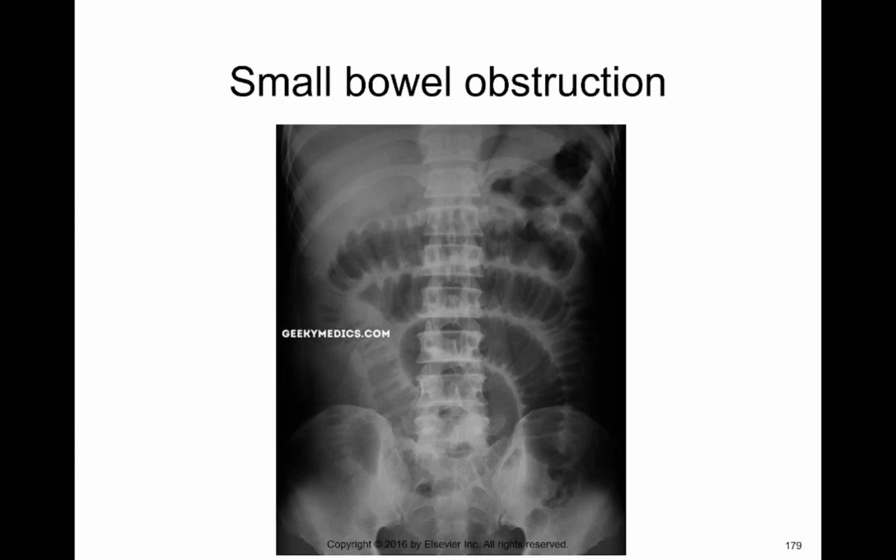a cancer, it could be because of a twisting of the bowel, and the visualization of that is what we refer to as a bird beak sign, and what we call that is a volvulus. And also another thing that we can have, and usually this is in the colon, is what we refer to as intussusception, and that's where a portion of the bowel slides inside of itself.